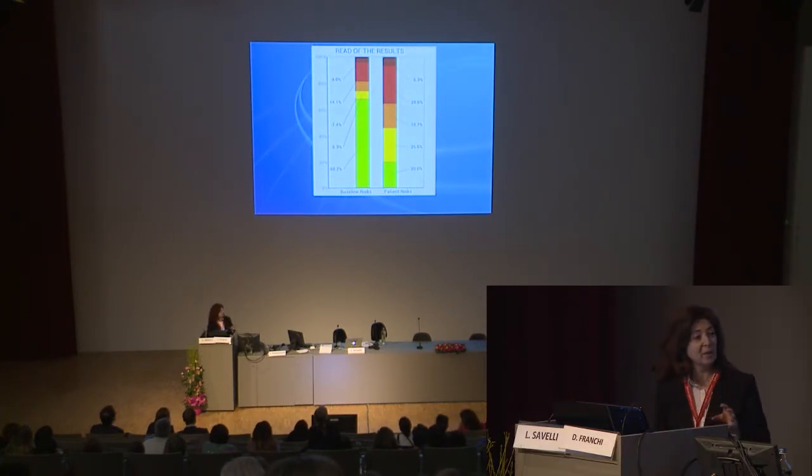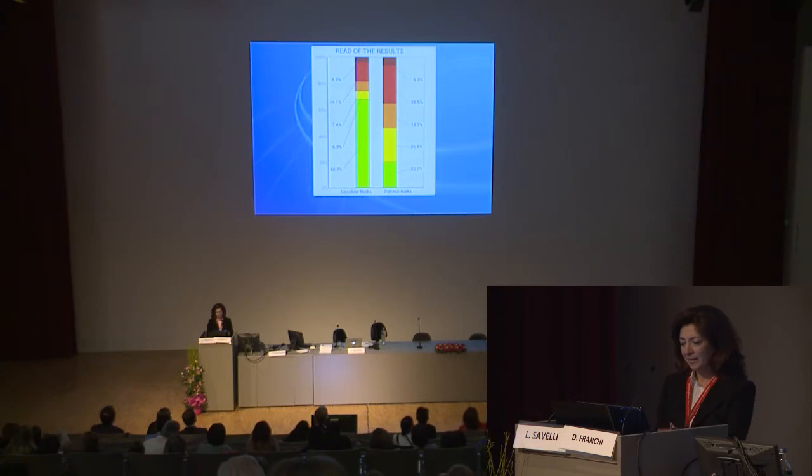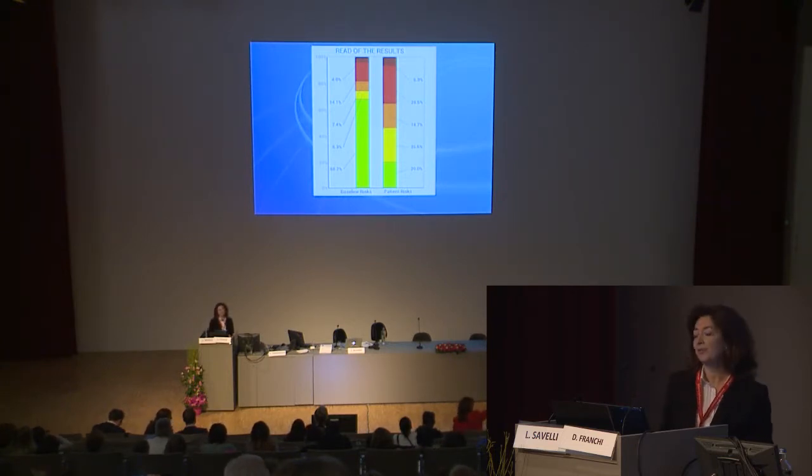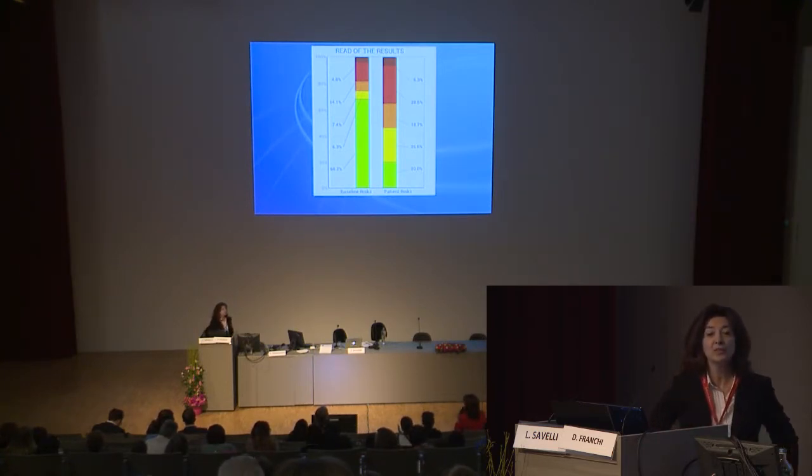Here I used the app, which you can find on your iPhone. And the borderline is indicated in yellow here. It was 26%. It's the yellow one, from 6.3 to 26.5. Also malignant invasive tumor, but the difference is higher for borderline tumor.